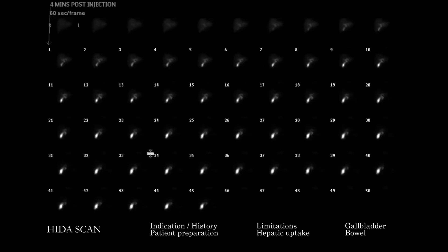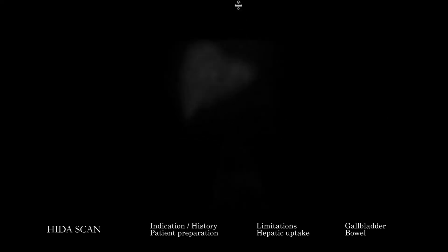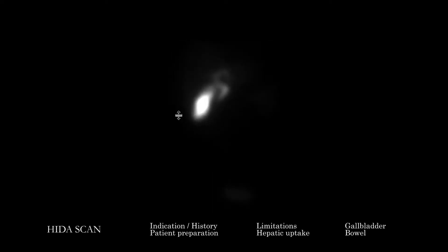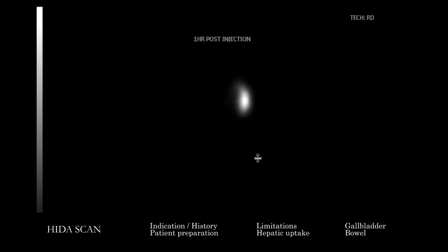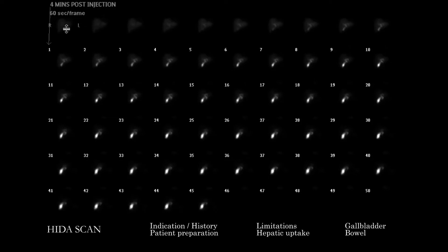As we look at the study, this is the summary image, and then we have the various time points starting after injection and going through to about an hour. We also have a single image — this is a right lateral view, which has been relabeled here. The summary information shows scintigraphic images at various time points, starting at just after injection, around four minutes post-injection, and following through for about an hour.